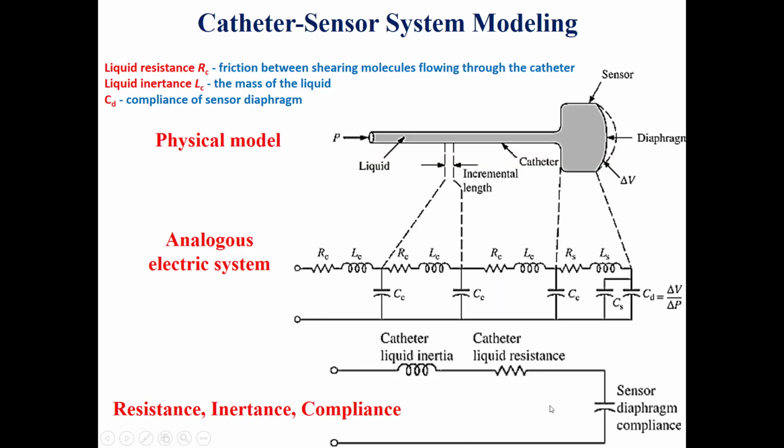This is the model which I have talked about before. The model is the catheter with the line which transmits the blood pressure wave to the pressure sensor, which is a strain gauge. So here is the input. We put in the pressure wave, which is the periodic signal, a summation of many superimposed sine waves, and it will enter this RLC circuit, which is a second order equation, as we know.